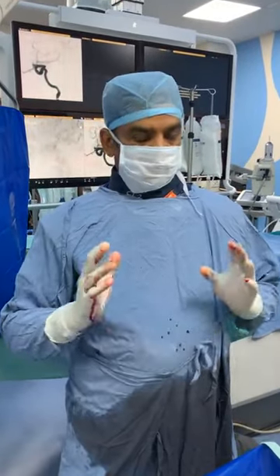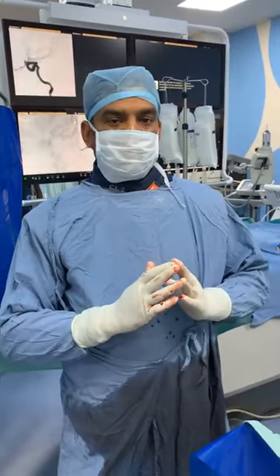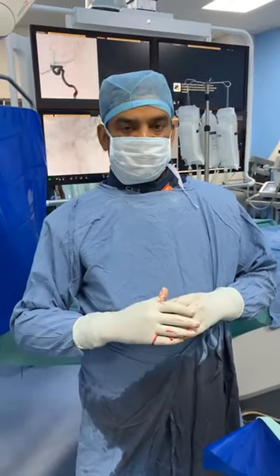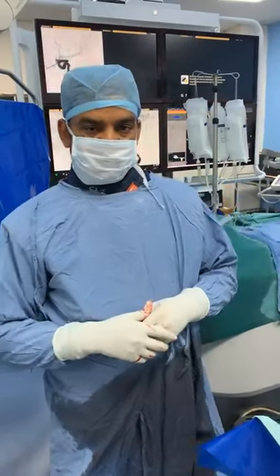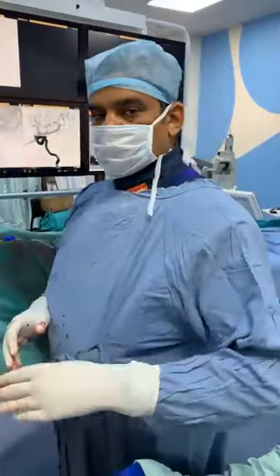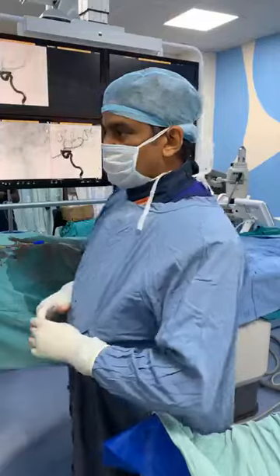And preferably we don't like instant thrombosis because the thrombosis might progress. So the results should be ideal when you have got some stagnancy in the aneurysm in 5 to 15 minutes time, and let it progressively thrombose so that the body handles it much better. And mostly once you get a cure with flow diverter, it's a lifelong cure. So we will do a check angio and close it because we have done a good job with the flow diverter. And further we do imaging with a vaso-CT, but that is not of interest to the general public.